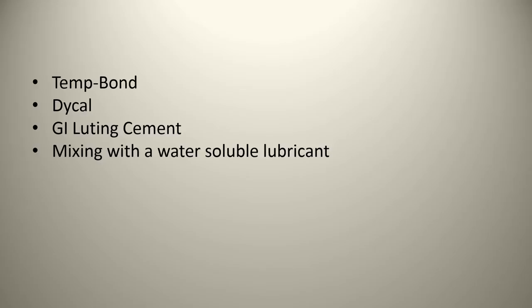And they couldn't get it off. The temporary cement just would not allow this crown to come off. Every year she would have this patient come back and try to take this crown off. This process went on for around 20 years, where this crown, which they were expecting to come off very easily because it had been cemented with a temporary cement, wouldn't come off. Just to let you know that sometimes temp cements can work a little bit stronger than we expect, and sometimes they don't. Also, mixing the cement with a water-soluble lubricant can help you reduce some of the bond strength properties of a temporary cement.